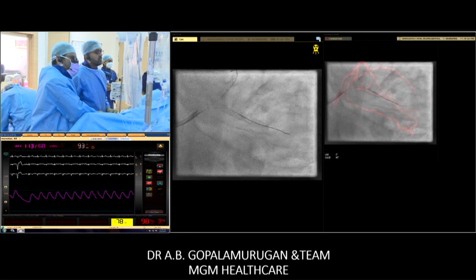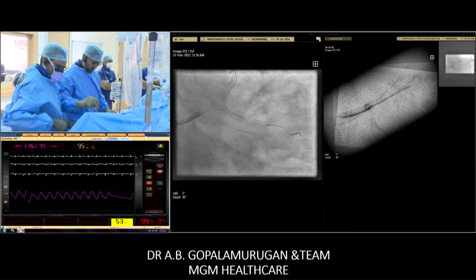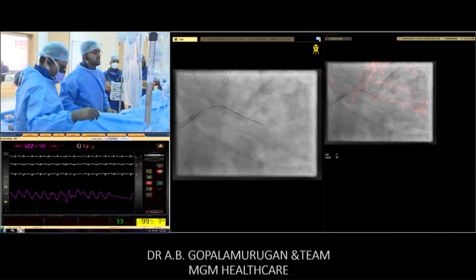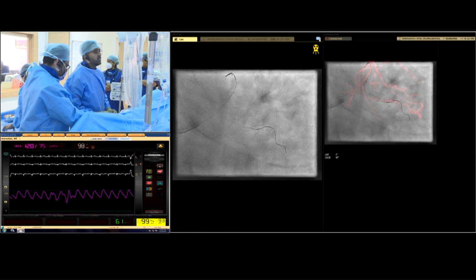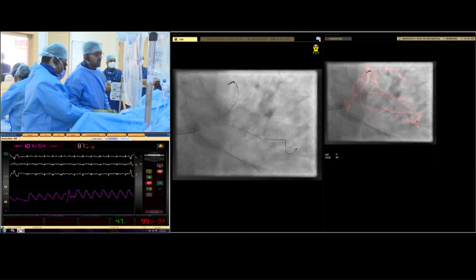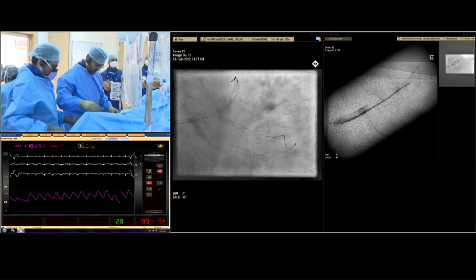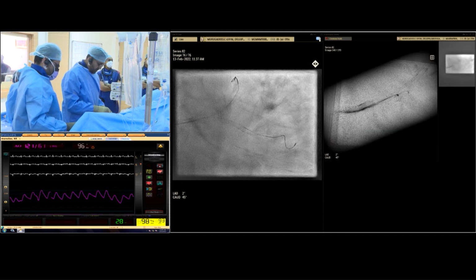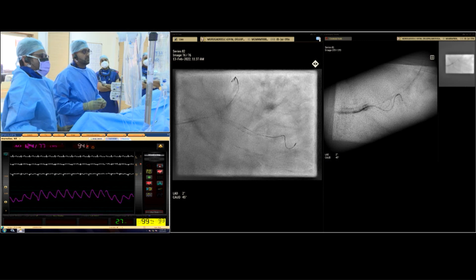Would you confirm with the OCT crossing, or will you accept? I usually won't be worried too much about that. Because fluoroscopically itself, I think we will know whether it is proximal or mid. Distal most we will avoid anyway, because of fear of subintimal, extra-stent passage. I personally don't believe that we should do an OCT to confirm that.